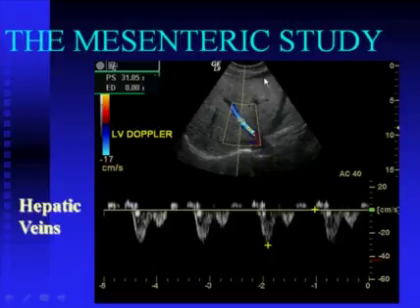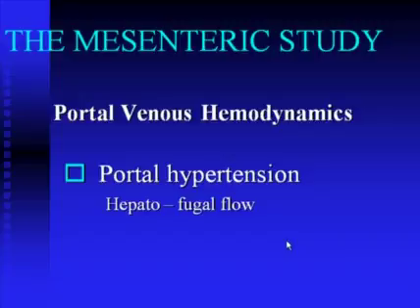Once you get through the liver onto the hepatic side, in the hepatic veins, you're going to see much more pulsatility at the heart rate, particularly since now you're emptying into the vena cava at a spot very close to the right heart. So you're going to see all of that heart rate pulsatility transmitted back into the hepatic veins, which you do not see in the portal venous system. So expect to see this kind of a pulsatile venous flow signal in the hepatic veins.